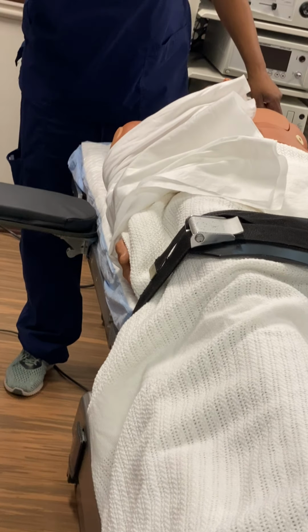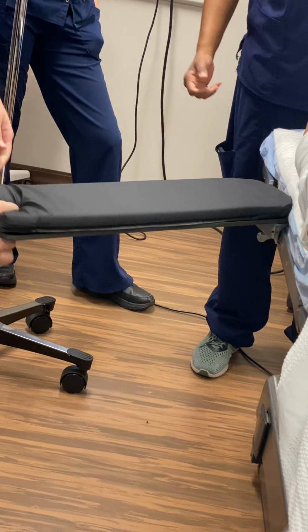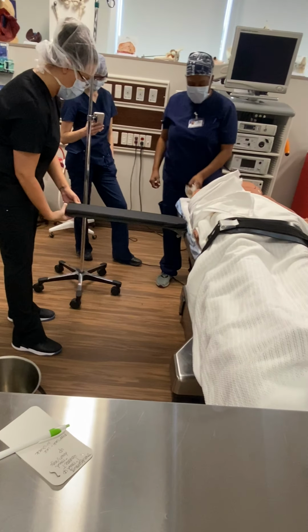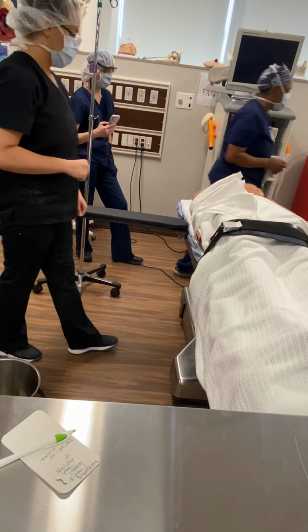Now as a move, that leverage helps them pull themselves over. It's a little hook thing. Typically I keep my hands right here, I don't turn around, and I don't help them, but I'm keeping them from going too far. We don't have another cushion here, so you can just grab this one right now.